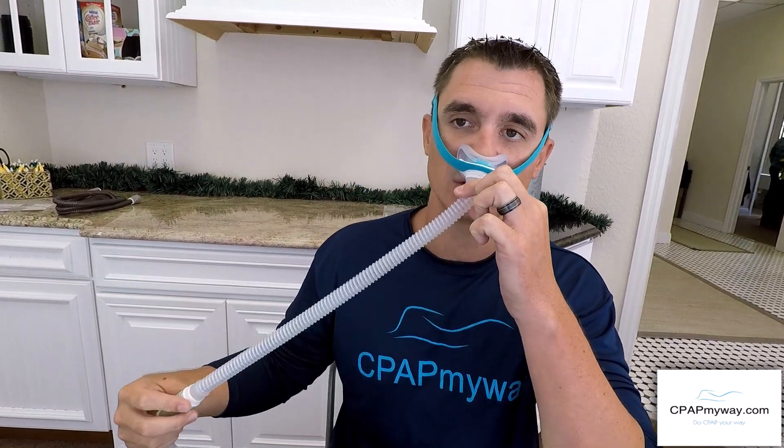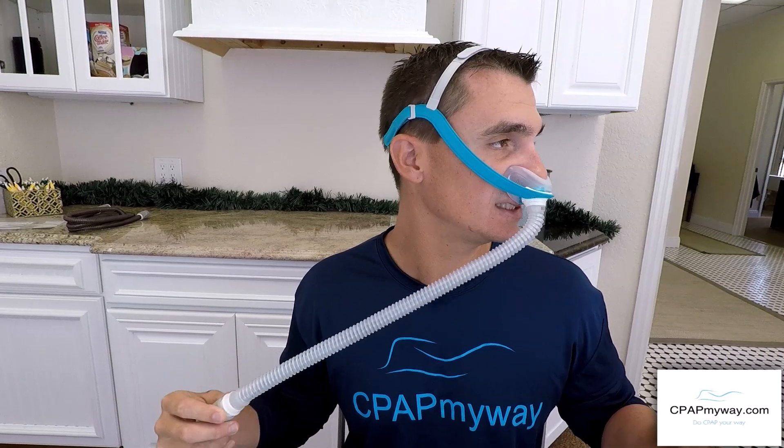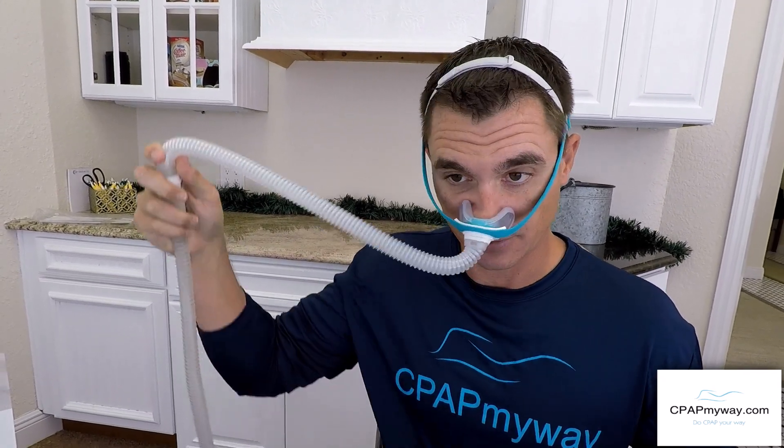It's got a stretch tube which gives you a little more freedom of movement side to side. As you can tell, if I'm moving around in bed I'm not getting any leaks at all — I can't even cause it to leak. So it's a really comfortable but effective fit with lots of freedom of movement while maintaining a high level of comfort.